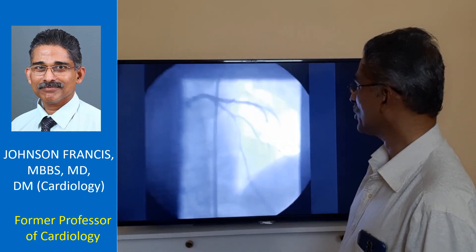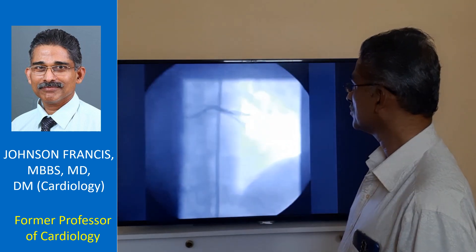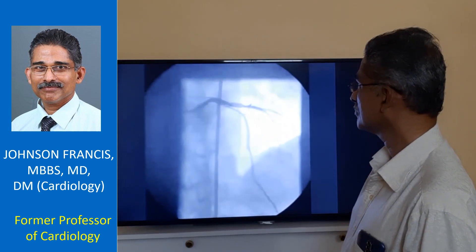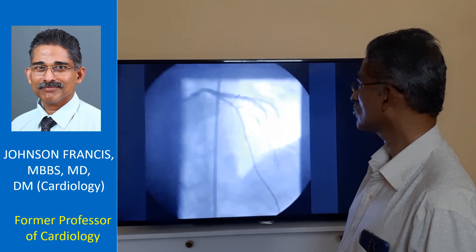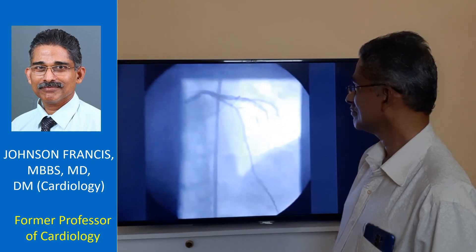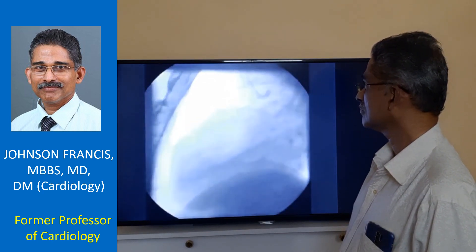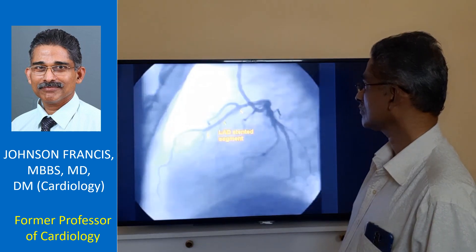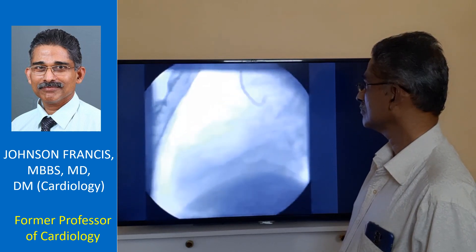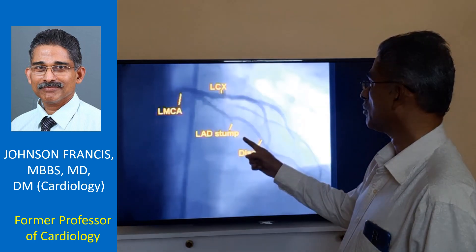Here I am showing the angiogram. This is the LAD seen over here. You can see the stented segment. This is the angiogram of the LAD.